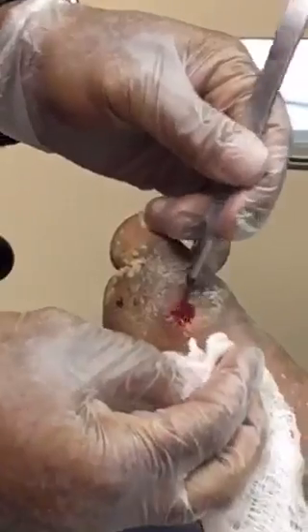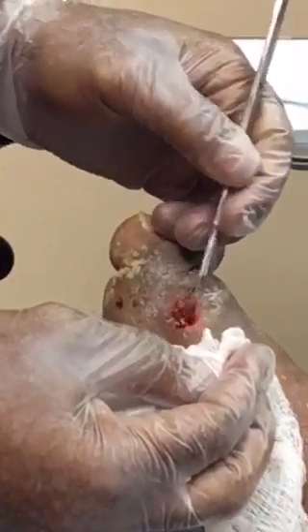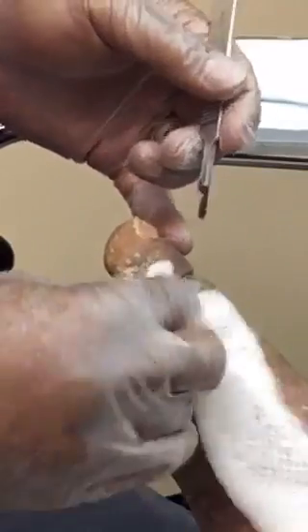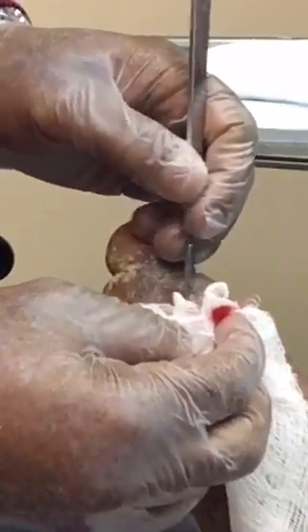Whenever you're debriding the wound, you should not be alarmed by seeing any bleeding. A bleeding wound is a healthy wound. A bleeding wound can heal — a wound that doesn't bleed has a lower chance of healing.